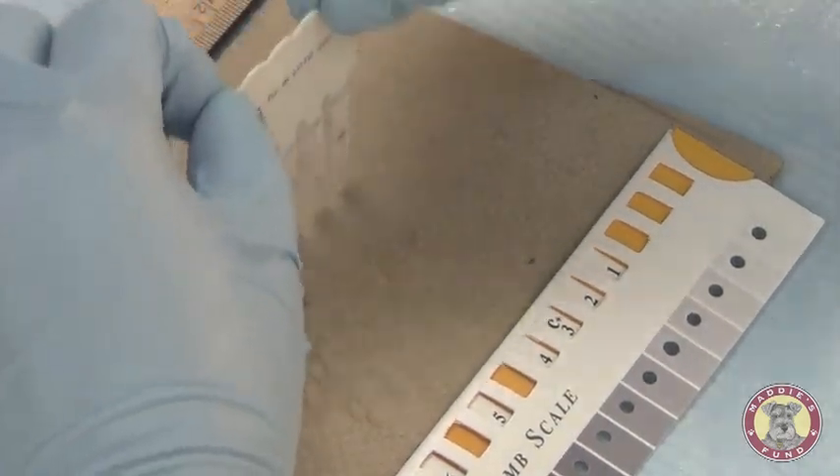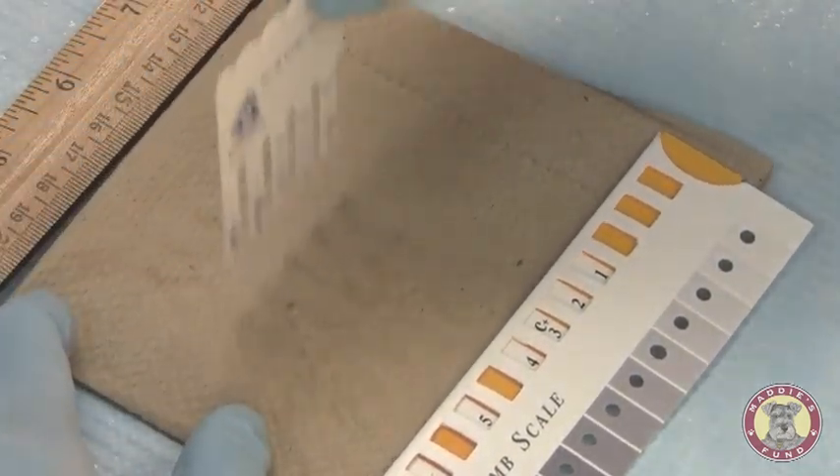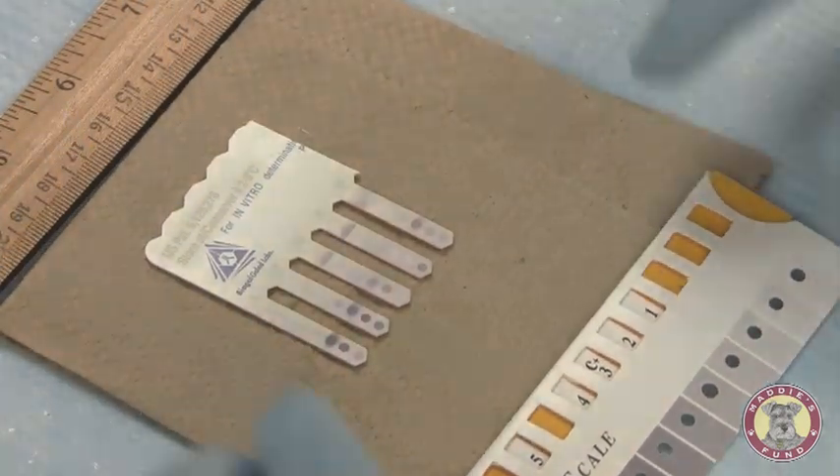Our comb is allowed to dry. As you can see tapping it, there's no excess reagent that comes off. Our color is fixed, so we're able to read the comb.